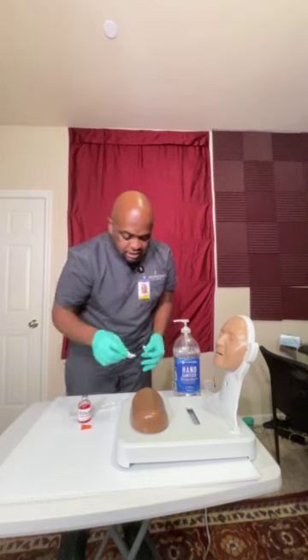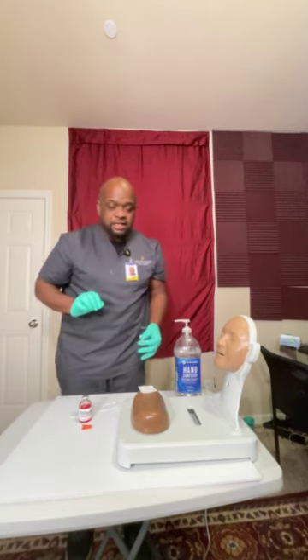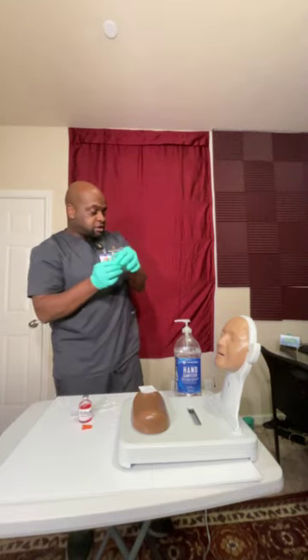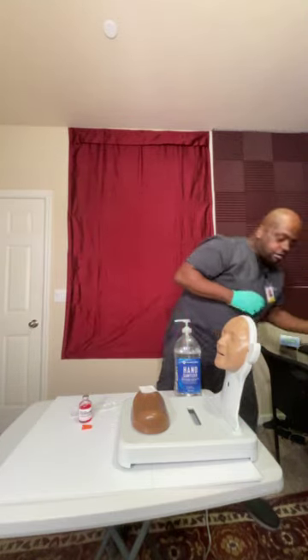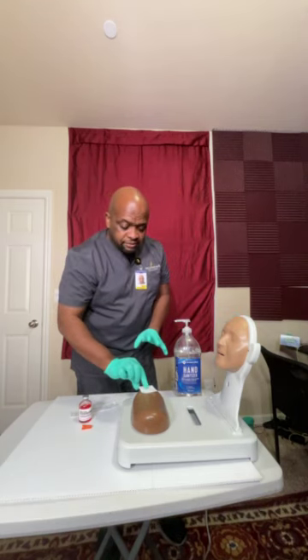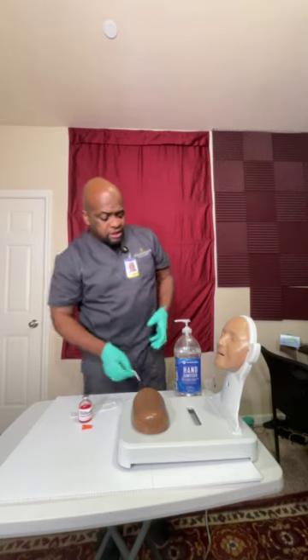And I'll go ahead and pull out the syringe. And there's a little bulge there. And I'll put the cotton swab there, just making sure that the syringe goes into the sharps container first of all. Put that in the sharps container. In case he's bleeding, I won't rub the spot. I'll go ahead and make sure there's no blood. There's no blood.